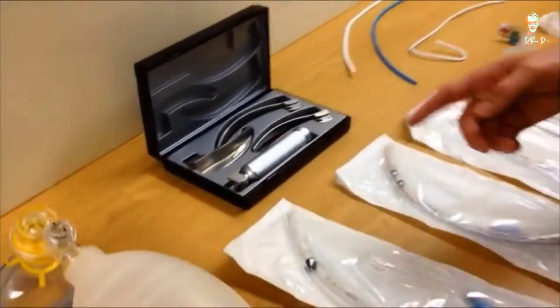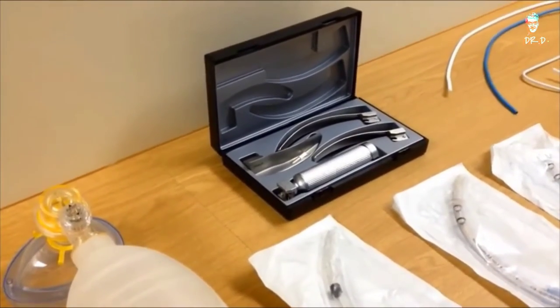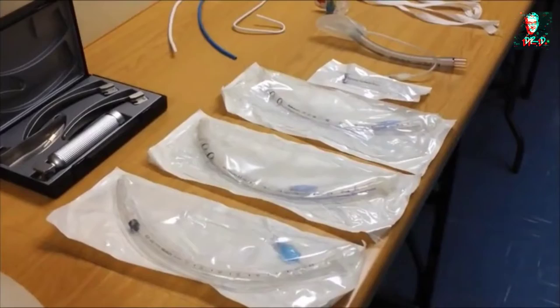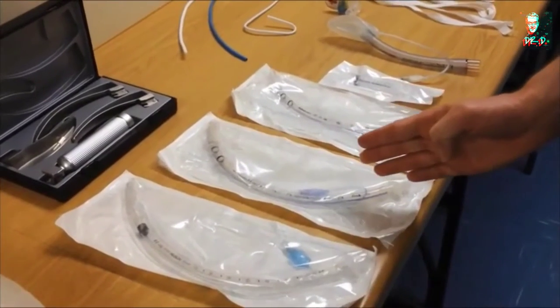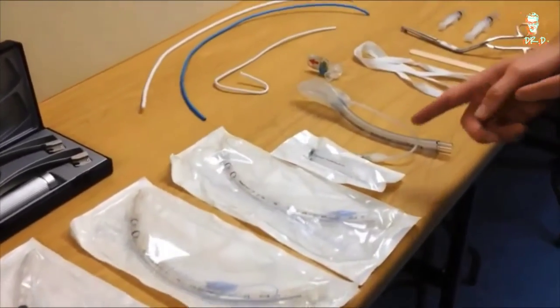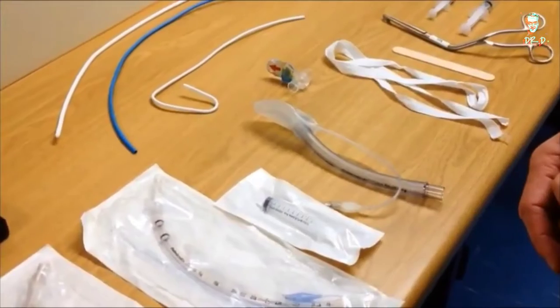You should have a laryngoscope with a selection of blades checked in good working order, and you should have a selection of sizes of endotracheal tubes. We suggest the size you're going to use and one size above and one size below. You should have a 10ml syringe to inflate the pilot cuff and the cuff of the ET tube.